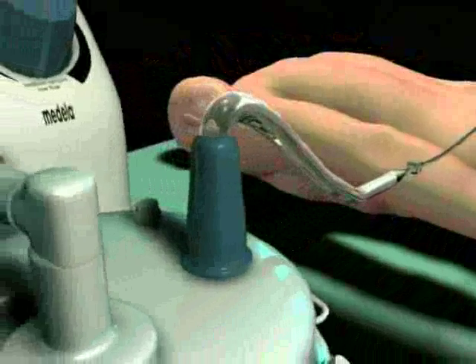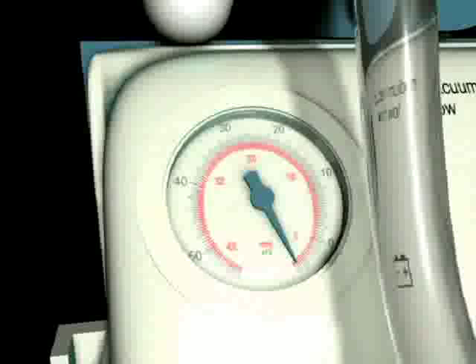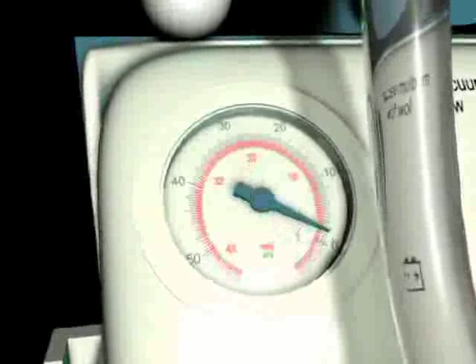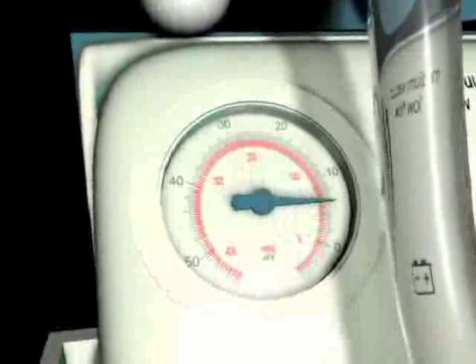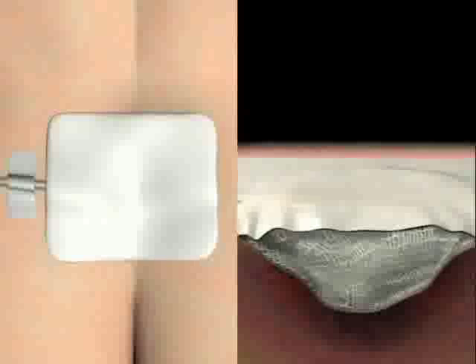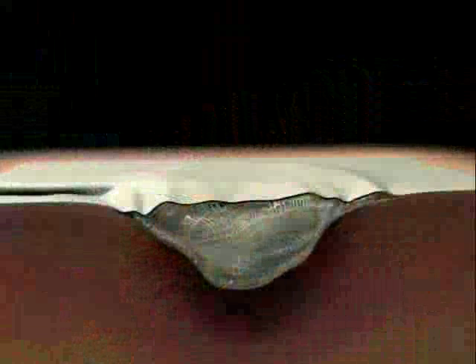Following the application of the Invia dressing set, apply a gentle negative pressure by setting the Medela Invia Vario between 60 and 80 millimeters of mercury with constant suction, as indicated by the red scale on the pressure gauge. Once the Invia Vario has been turned on, the dressing should contract noticeably as it applies the negative pressure to the wound. This application of negative pressure elicits the removal of the wound exudate and mechanically stimulates the wound tissue, promoting wound healing.